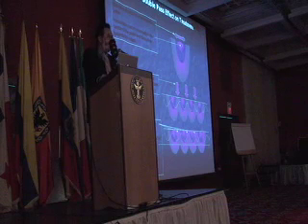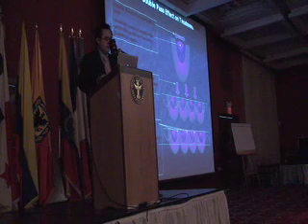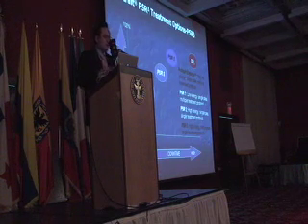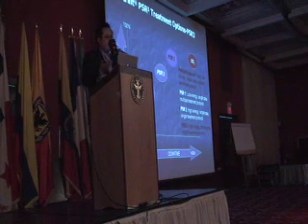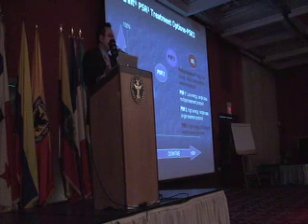Row after row, finish a subunit of the face, and then come back and do your PSR3 double pass settings. So here's that added PSR3, where I think the makers of this product are pretty honest. They're not equal to CO2, but they're very good at PSR3 settings.